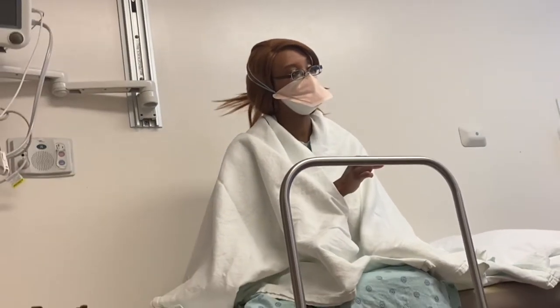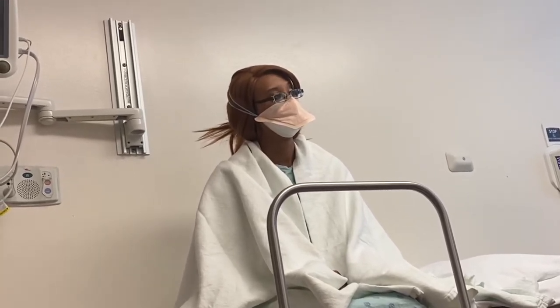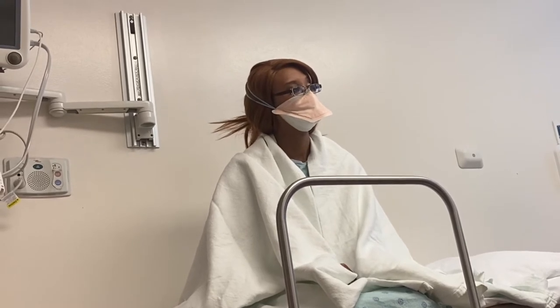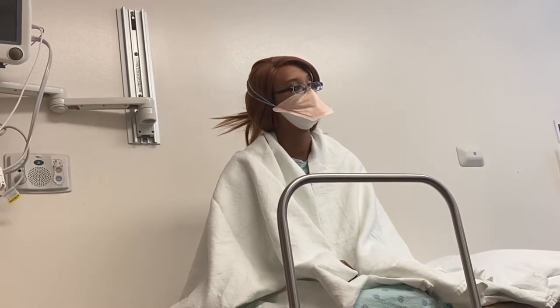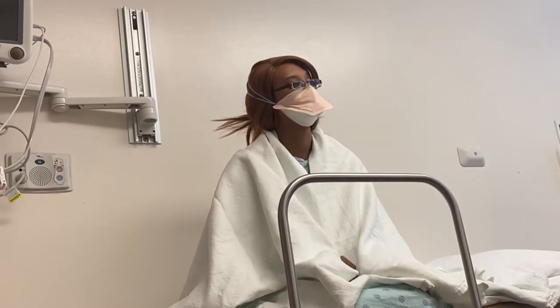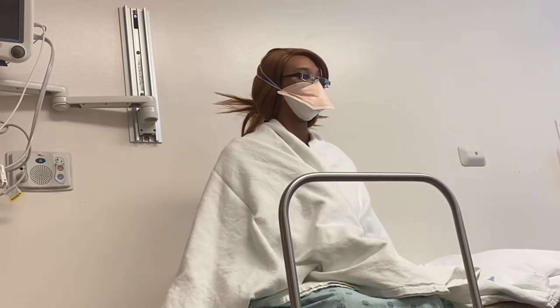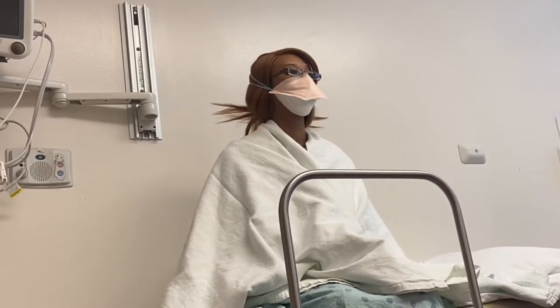So will that test be able to tell if my little sphincter is closing off? Mm-hmm. It gives them that number. That's why I said this test is all about pressures. What number is your esophagus squeezing at? What number is your sphincter squeezing at? Is it resting like it's supposed to? Relaxing like it's supposed to? But sometimes when you have different things, one of them can be real tight. And it just stays tight, and you eat, and stuff just comes back up, and you throw up. So it's staying tight. And then sometimes your esophagus is just not squeezing like it's supposed to. So you eat, and it just sits there. And so we'll be able to see the number in your esophagus.